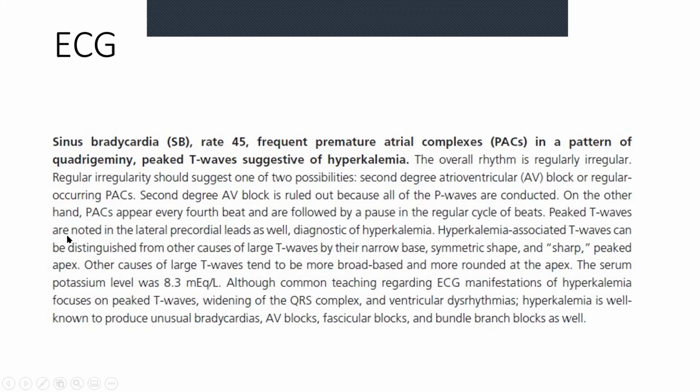Hyperkalemia-associated T waves can be distinguished from other causes of large T waves by their narrow base, symmetrical shape, and sharp peaked apex. Other causes of large T waves tend to be more broad-based and more rounded at the apex, as I was showing you.